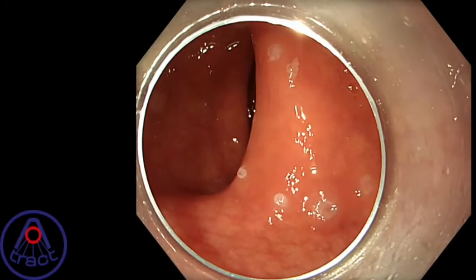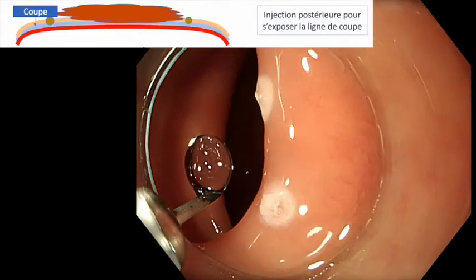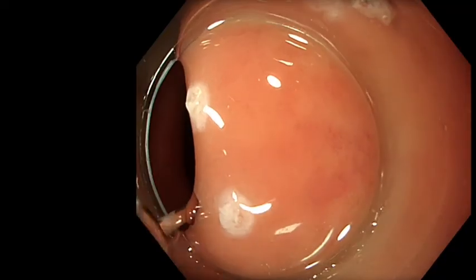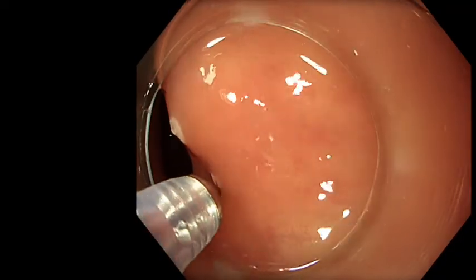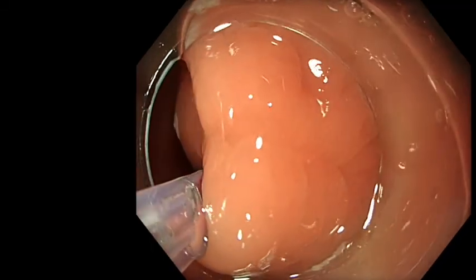And therefore, after, you will cut it. Here, for example, it's a difficult lesion because the area you want to cut first is in the valley. It's not facing the mountain, so it's a very difficult case.